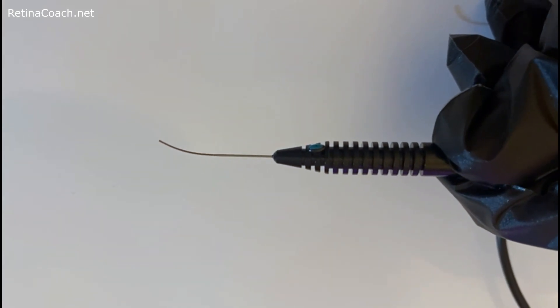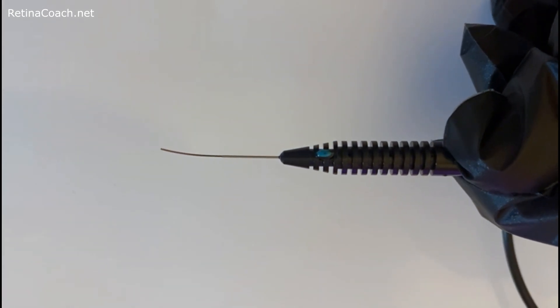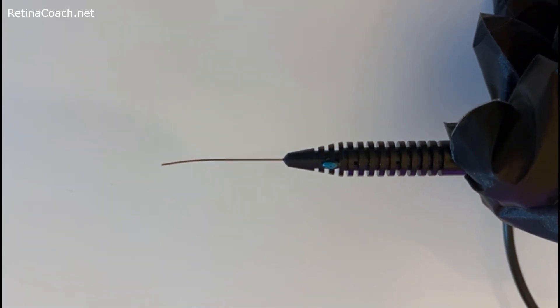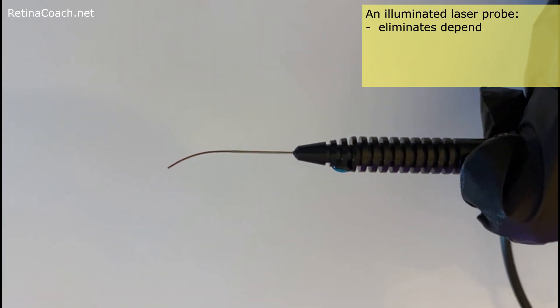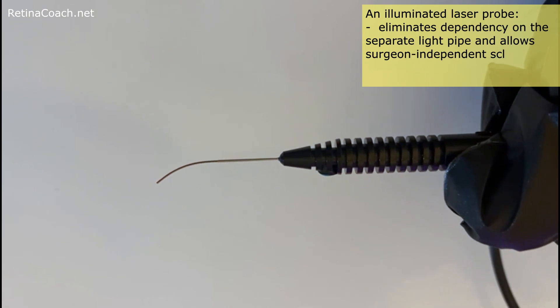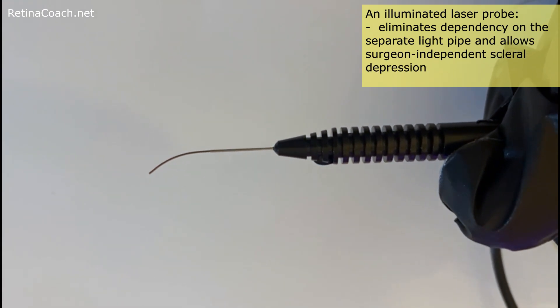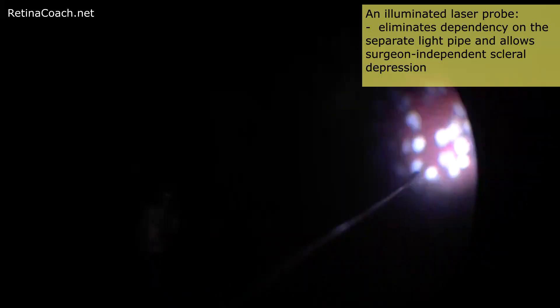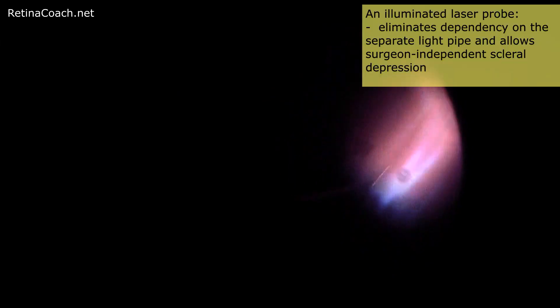The illuminated laser probe has an optical fiber integrating lighting and laser abilities. Therefore, this probe eliminates dependency on a separate light pipe and allows the surgeon independent scleral depression for peripheral retinal breaks during laser treatment.